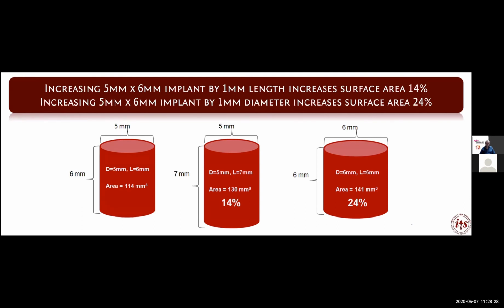However, we must be cognizant that if the diameter of the implant encroaches on the thin crestal cortical bone, this pressure will produce bone resorption. To counter this, it is suggested to have about a millimeter and a half of bone circumferentially around the implant.